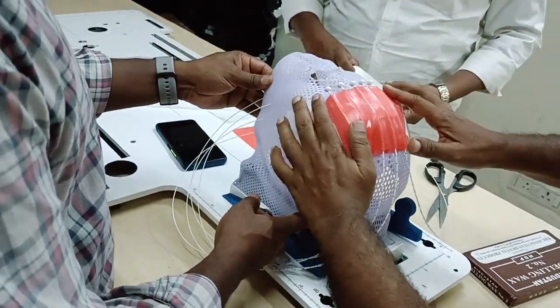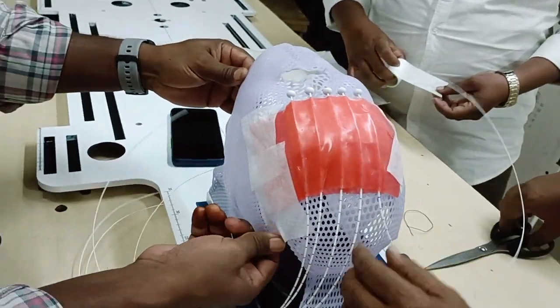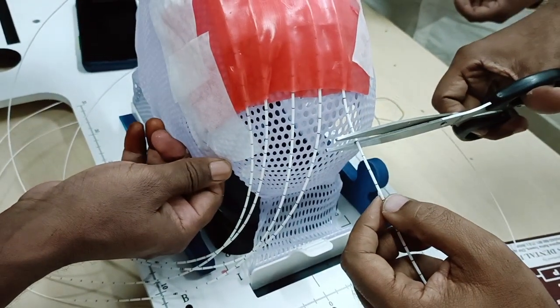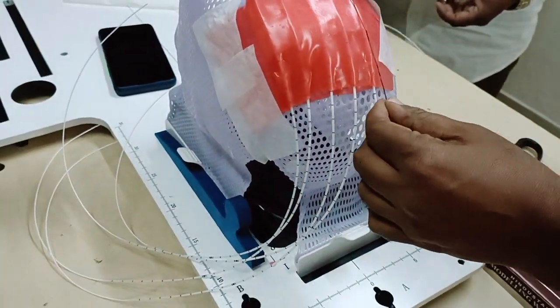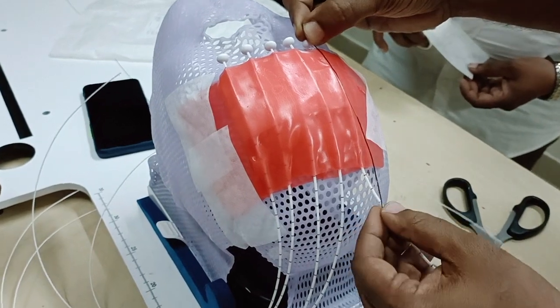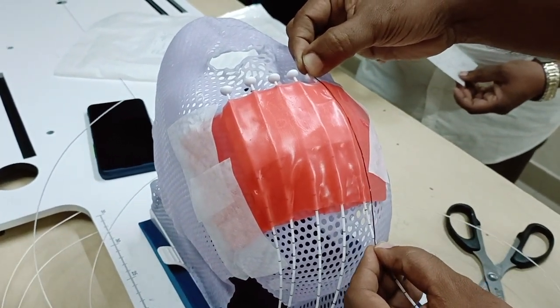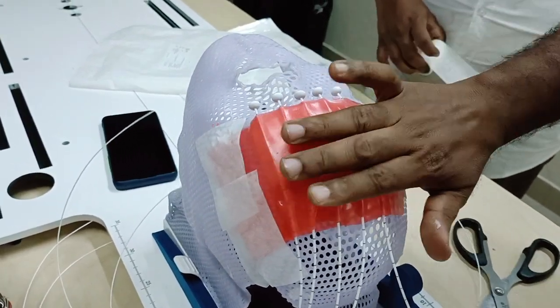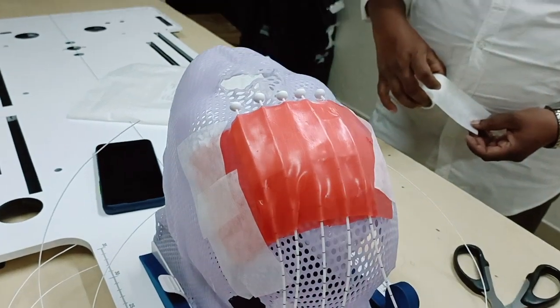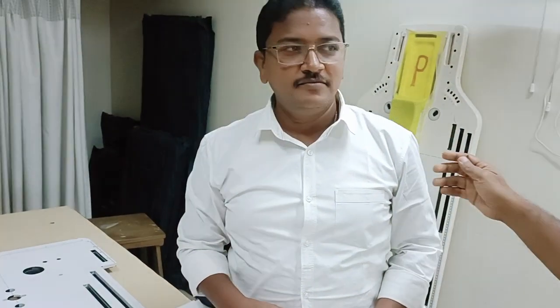After that, you have to cut and place the copper wire during the CT scan. It will take the markings during the CT scan. This is the easiest way to make a mold, and our radiation department technologists — Mr. Manu, Mr. Ganesh, and Mr. Sunil — do all of these things.